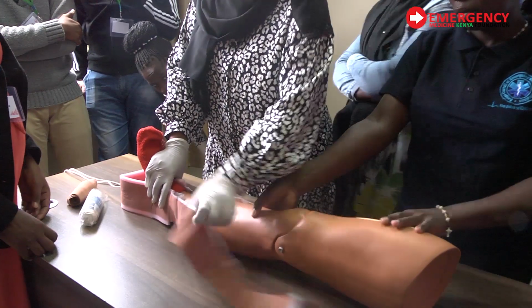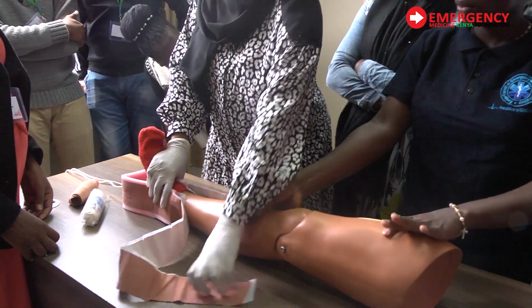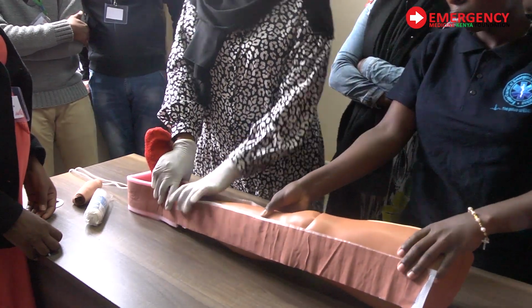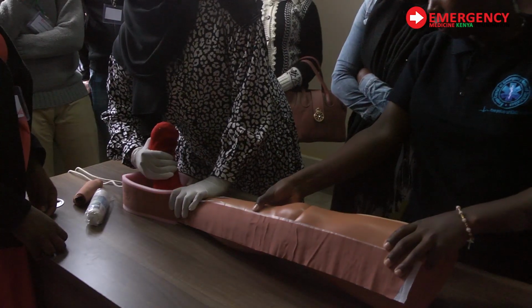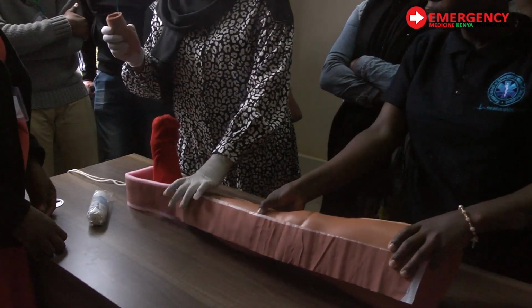And then hold. So this tape we normally remove, okay? So it sticks on the patient, okay? You do that, okay? So I've given the patient analgesia, right? So I pull my leg, right? I have reduced it, okay? It will be very lax and easy for you to do this. So I've done that, I have this, so the next thing is to secure, okay?